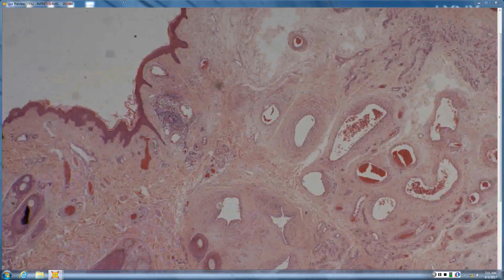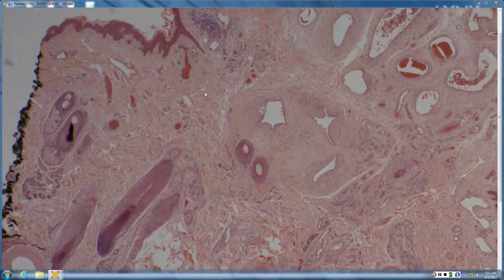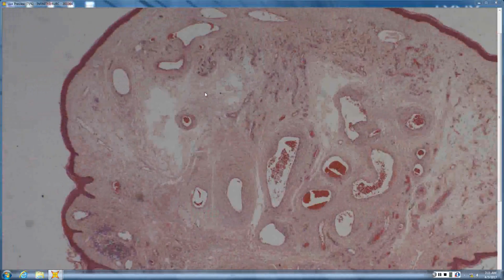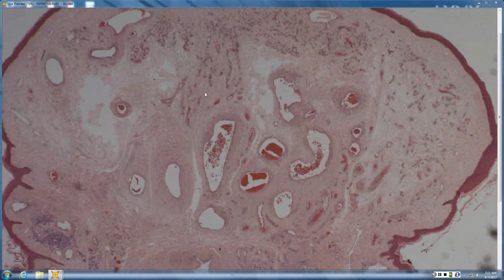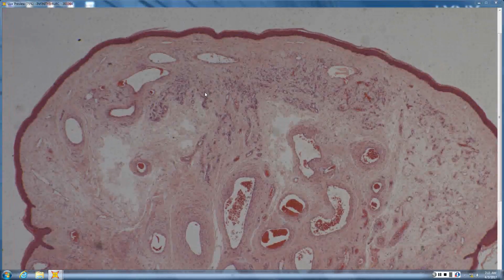Okay, so this one is just an AVM, or arteriovenous malformation, and this one is a pretty good one because sometimes in derm path we see a lot of capillary hemangiomas or little cherry angiomas. Those are usually pretty easy to diagnose. They've got more hyalinized vessels. They're all sort of the same size and well defined up in the superficial dermis.